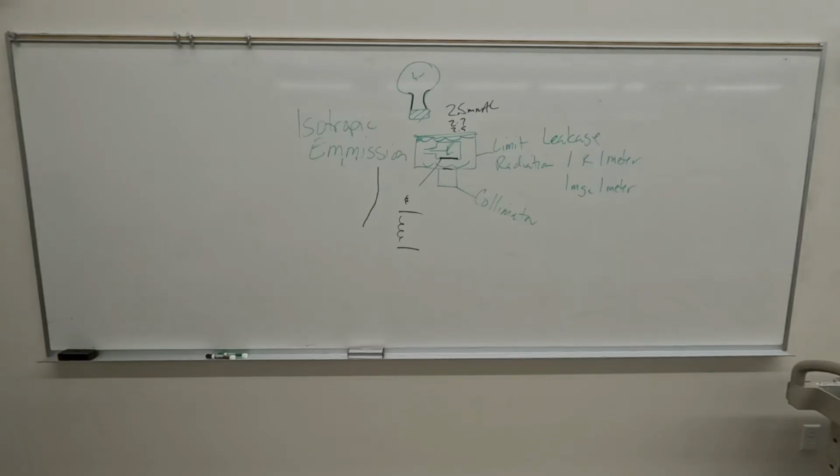The anode is also going to be... you know, I always want to flip those. The anode or the target area is going to be thorium. I always want to flip those two. I don't know why. It says the filaments are made of thorium. Yeah, thoriated tungsten. Yeah, it is thorium. It's thoriated tungsten.